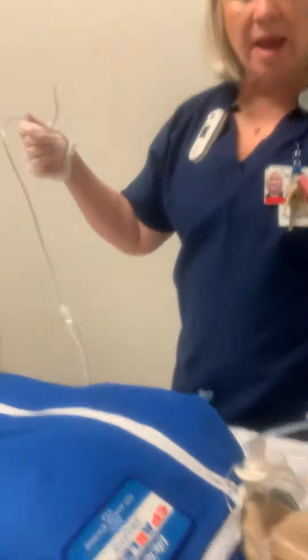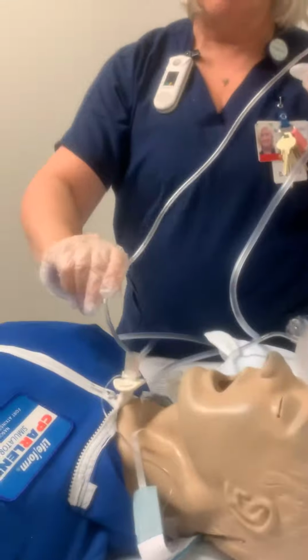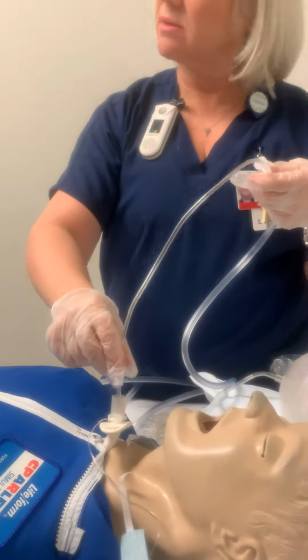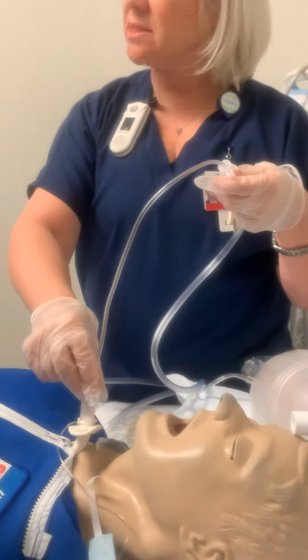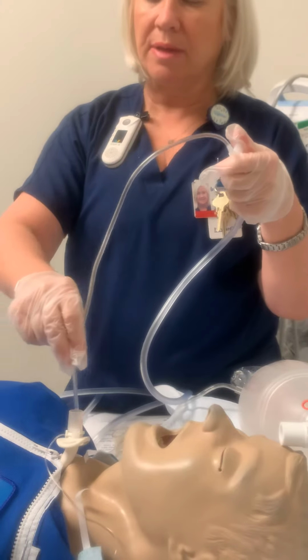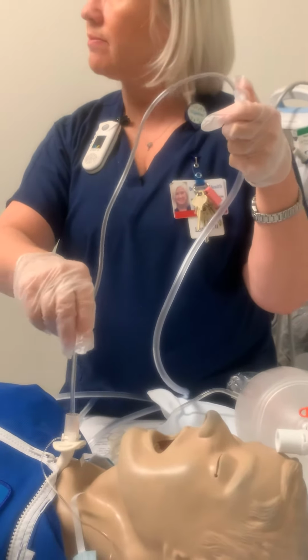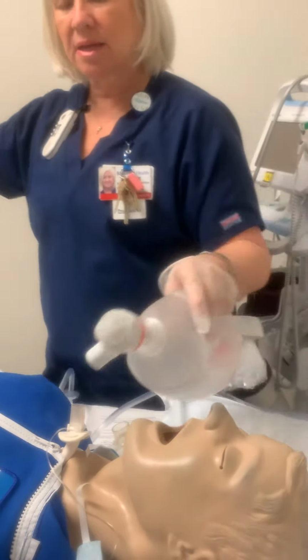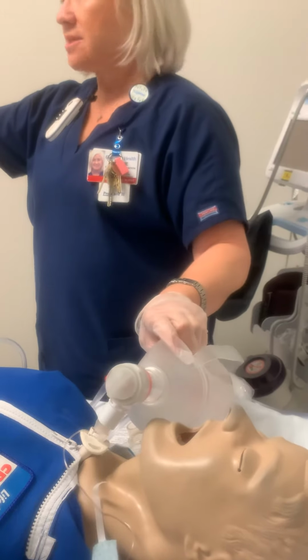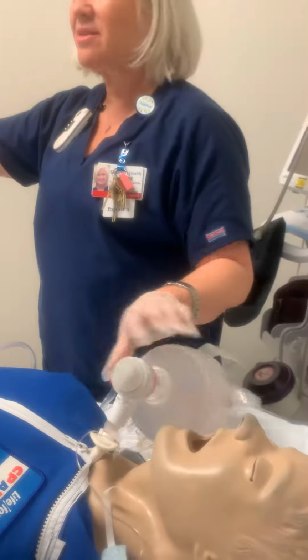Okay, so I'm going to ambu them with 100%, a couple of breaths. I'm going to go in gently. I feel my resistance come back a smidgen, put my finger on the suction, bring it up, slowly circle, come up, no more than what? 15 seconds, and then I can bring this over, and you kind of want to hold this over here and give them a little bit of oxygen, because they're going to have air hunger. They're literally going to use the suction to pull all their air out.